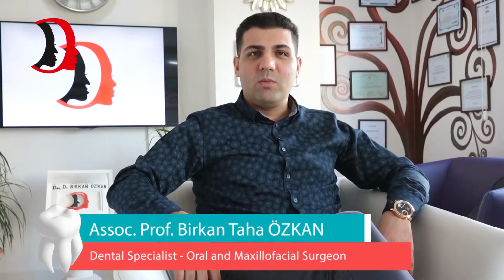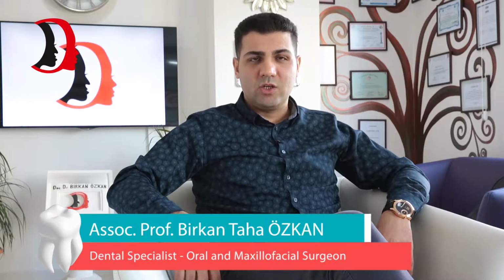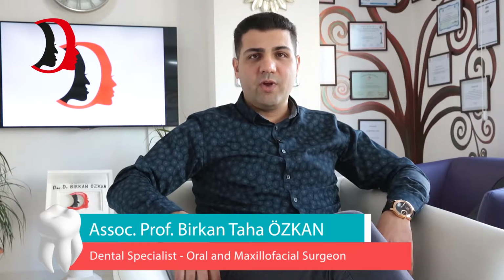I would like to mention dental implants today. A dental implant is a material which is placed into the missing tooth region or a totally edentulous region to hold prosthetic crowns and bridges. The implant procedure is one of the best ways for prosthetic rehabilitation of an edentulous region. The main purpose of implant insertion is to obtain effective chewing and aesthetic considerations.